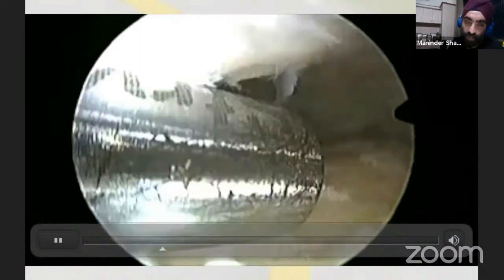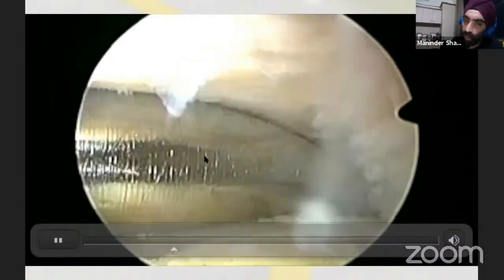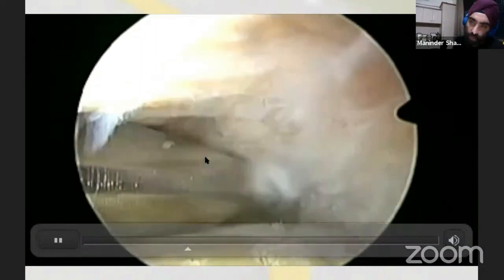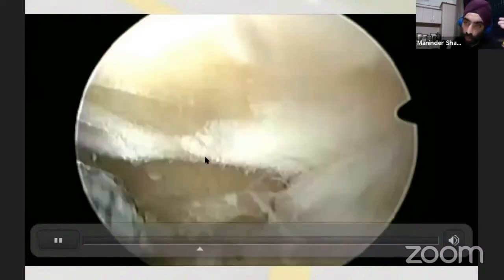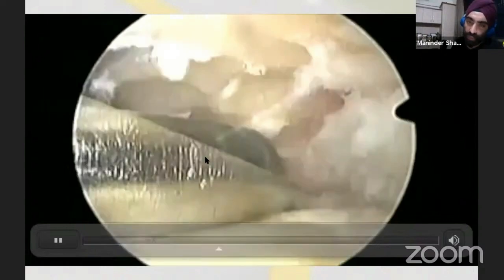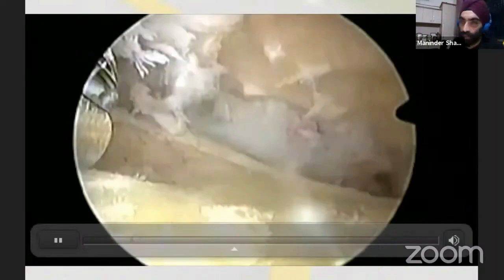In an ankle arthrodesis fusion you don't need to protect any cartilage — you have to get it all off. Use the shaver and the 4mm barrel burr to debride the cartilage and the thick subchondral bone. Notice that in ankle arthroscopic fusion you will have ridges, and that's quite normal. A ridged surface is better than a flat surface for arthrodesis — the two surfaces interlock when fixed, giving a more stable fusion.